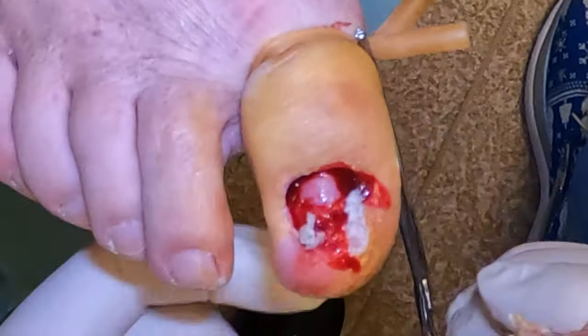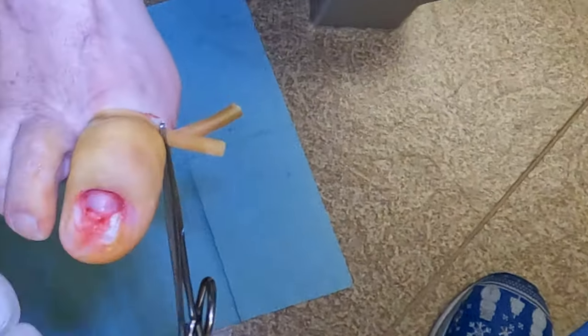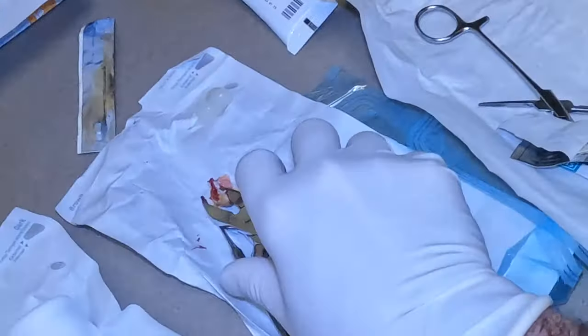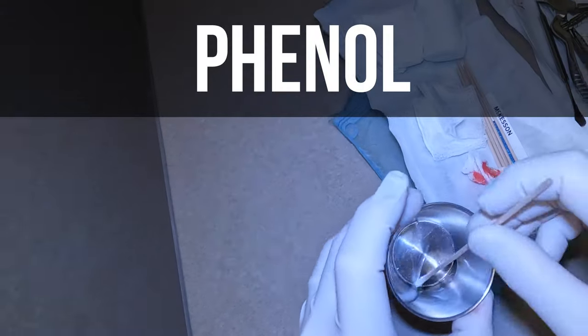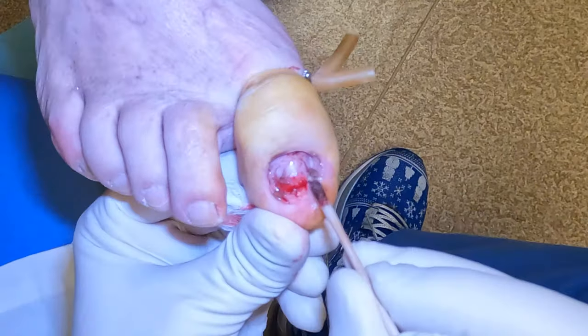The nail easily pulls off. You can see some callus tissue and debris that's collecting under the nail plate — we will remove this. Then the next step is to use phenol, which is a chemical that's going to create a chemical burn to stop the nail plate from growing back.